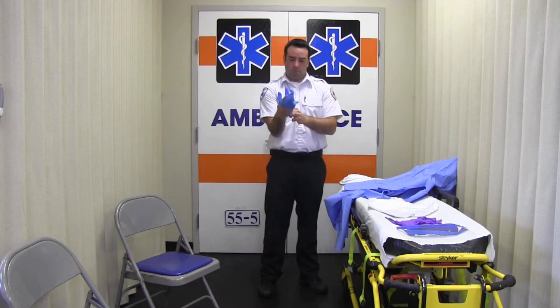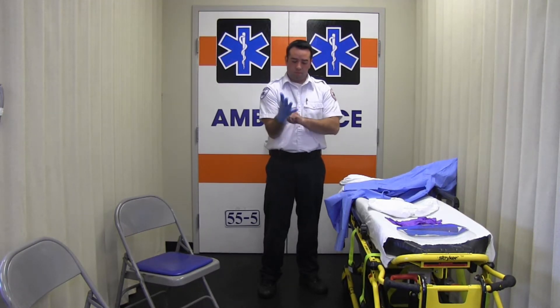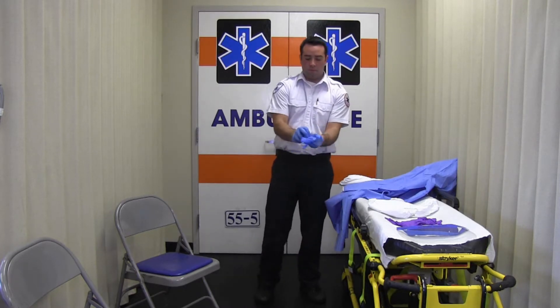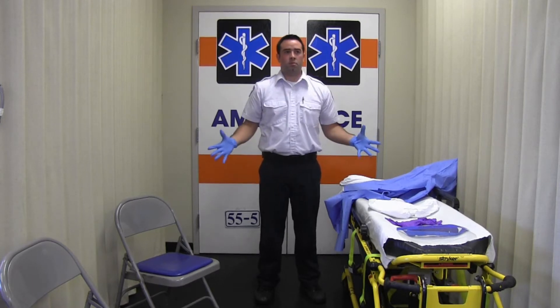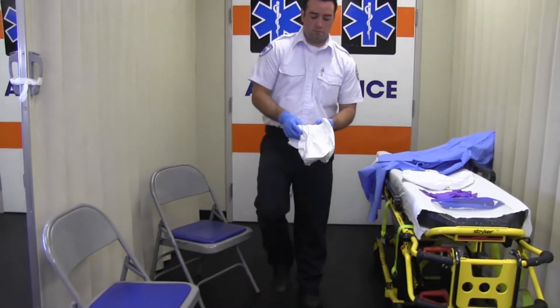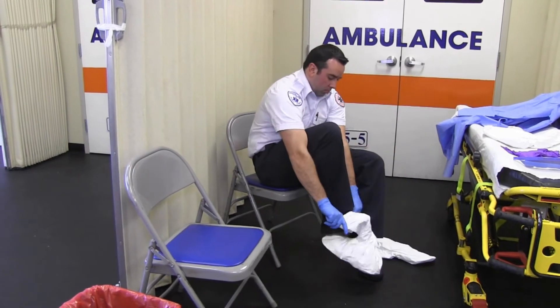Now you will put on your first pair of gloves, which we will refer to as your inner gloves. These gloves may be regular or extended cuffs. Once your gloves are on, you will put on your boot covers. You may need to take a seat to do this safely. The boot cover should extend to the mid-calf and preferably have a non-slip sole.